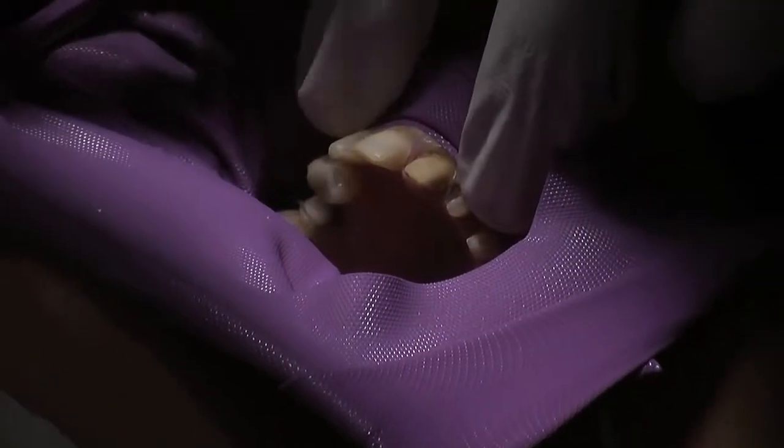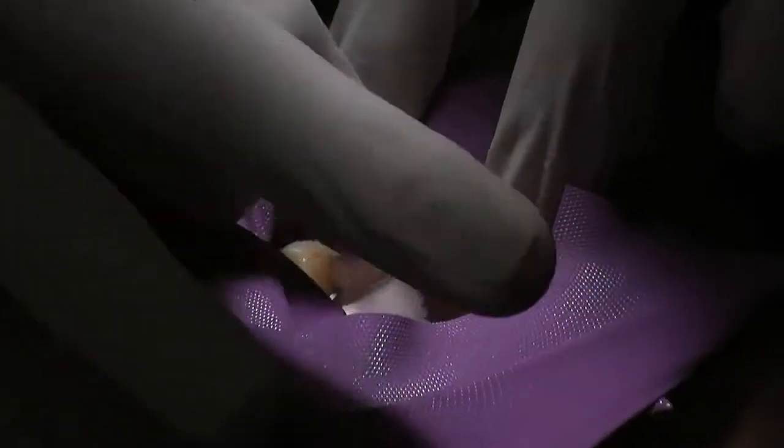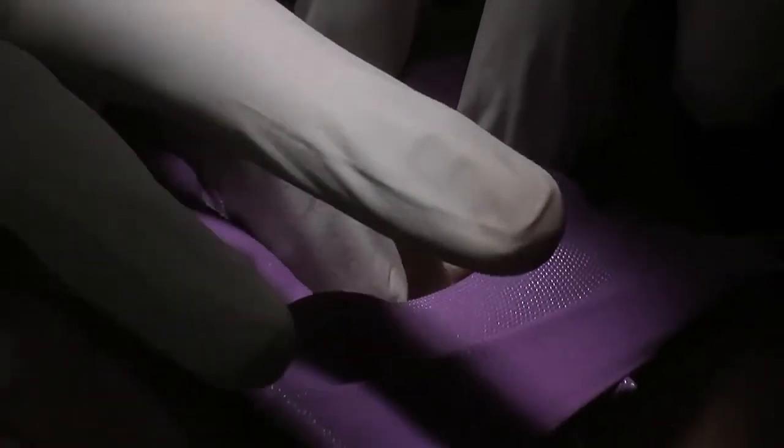To get the perfect isolation, so it's completely dry, I'm going to use a piece of gauze just to cover up the back area which is exposed, just like so.